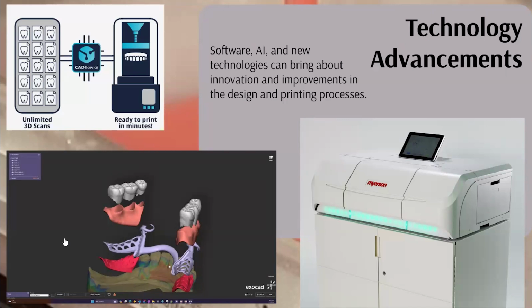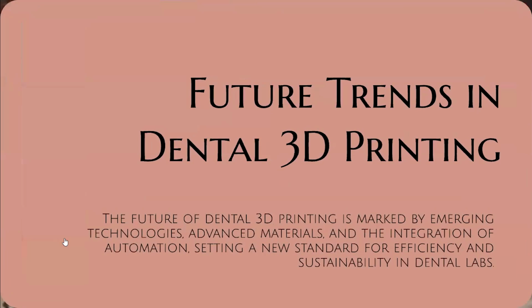I think there is one that's been commercially available for a couple of years, but the dentures, at least coming out of that one, are not high impact. So in my world, it's all about dentures most of the time, and so that was my focus. But it can also print models and everything. This one is really dialing in on the dentures, which is exciting for me. And being a jetted technology, that just frees up lots of things about color and layers. But the biggest part it frees up with labor is that the dentures come out pretty much done, maybe a little polishing. So there's no assembly or parts or pieces, right, you have to worry about. And that's the big win with jetting.